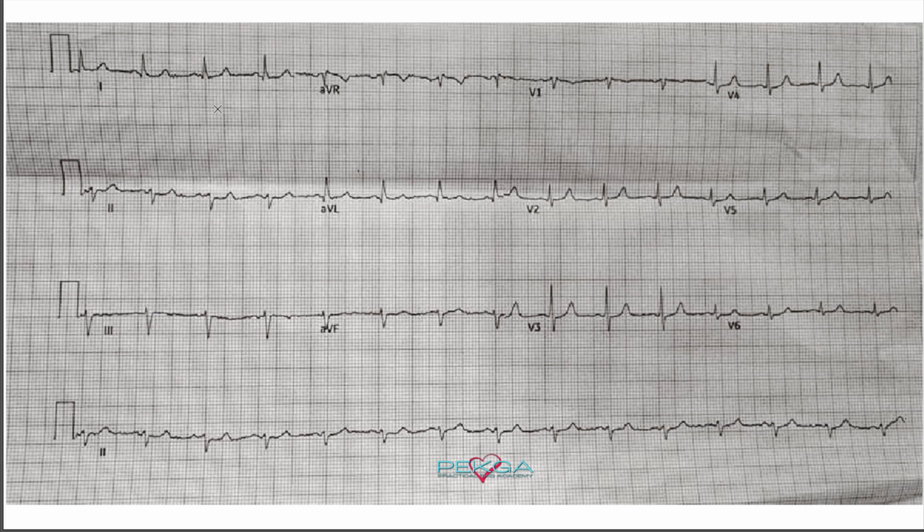So what happened here, they had this lady blow on a syringe, right? Of course, there's no needle on that syringe. What happens is the person blows on the syringe, and it forces the vagal nerve, your cranial nerve number 10, to kind of go into hyperdrive, if you will, and it slows down the rate. And this is what happened. So they successfully converted this lady from SVT into, now let's take a look at this rhythm.